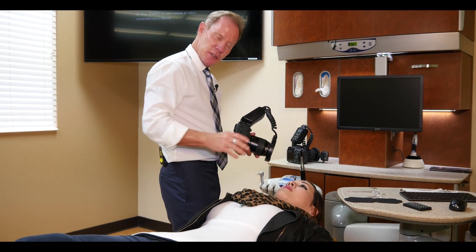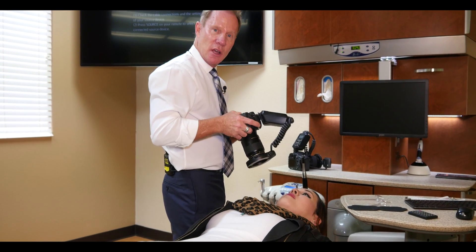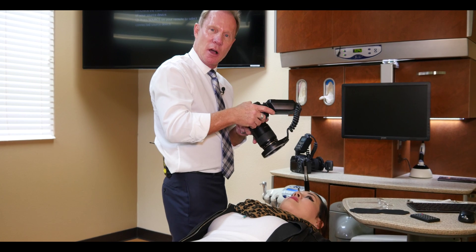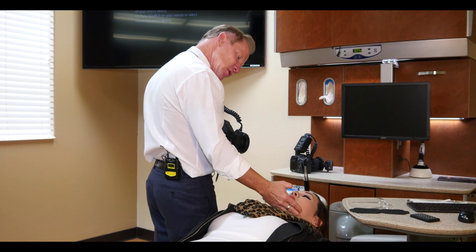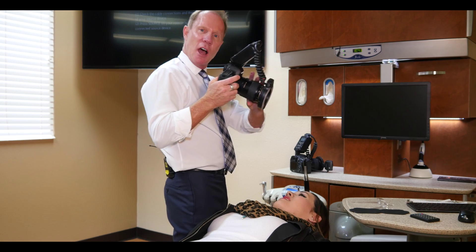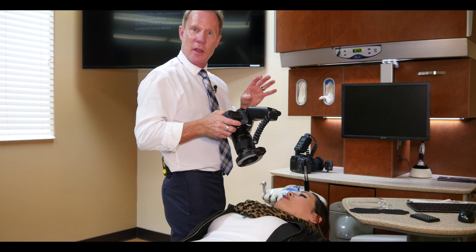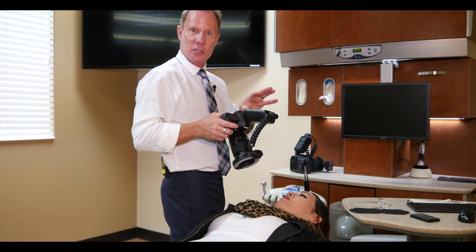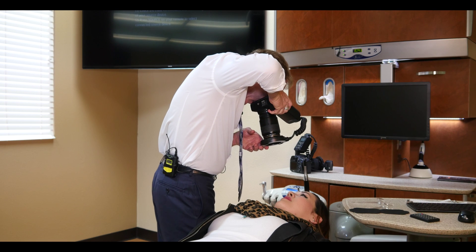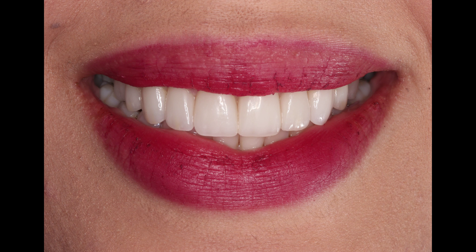By having Marissa in a horizontal position, I can be above her and the camera naturally wants to go straight down — so I'm not moving my arms or body position to compensate for the weight. Turn toward me, Marissa. This is a one-to-two. We do not focus — we move the camera in and out to maintain the same magnified image for pre and post comparisons. Big smile, tongue back.